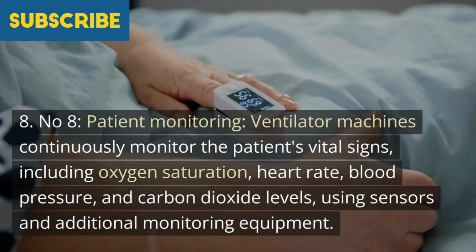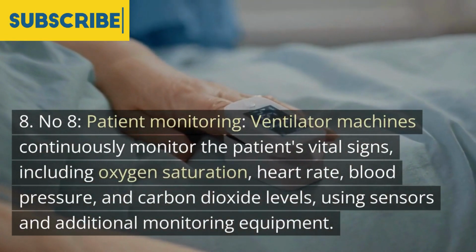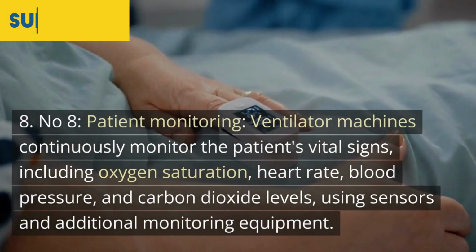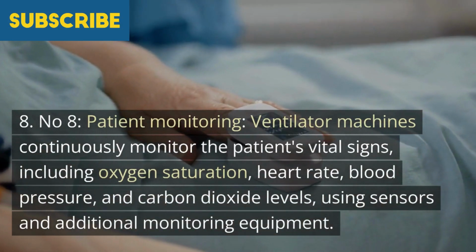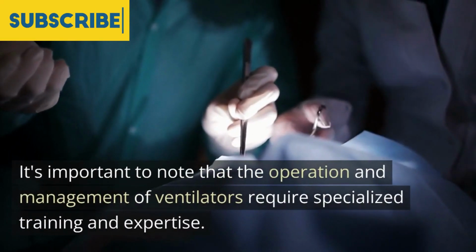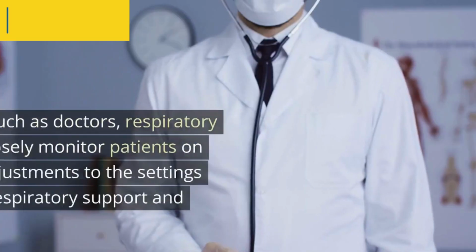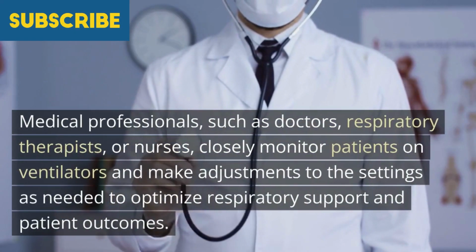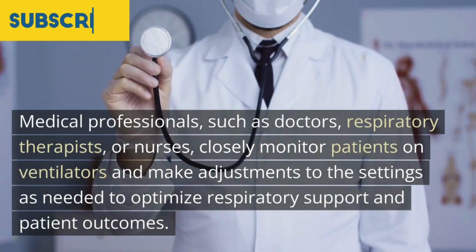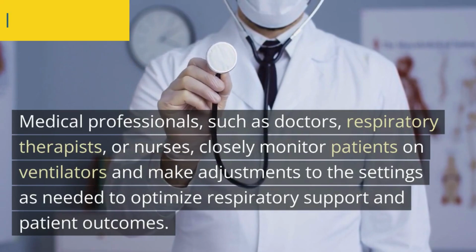Number 8. Patient monitoring. Ventilator machines continuously monitor the patient's vital signs, including oxygen saturation, heart rate, blood pressure, and carbon dioxide levels, using sensors and additional monitoring equipment. It's important to note that the operation and management of ventilators require specialized training and expertise. Medical professionals, such as doctors, respiratory therapists, or nurses, closely monitor patients on ventilators and make adjustments to the settings as needed to optimize respiratory support and patient outcomes.